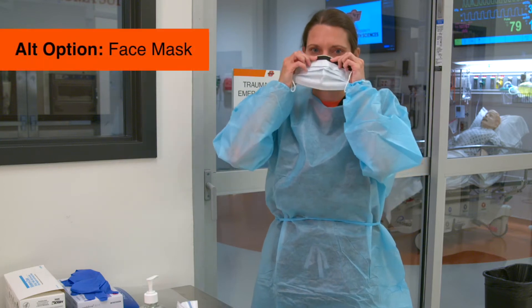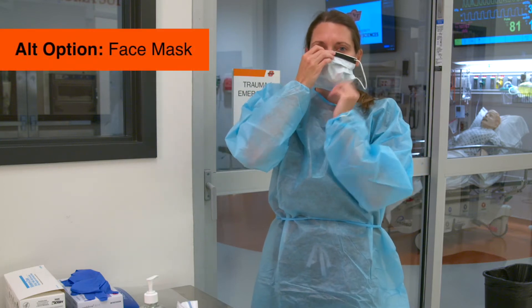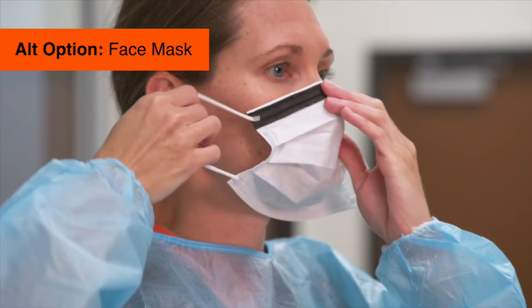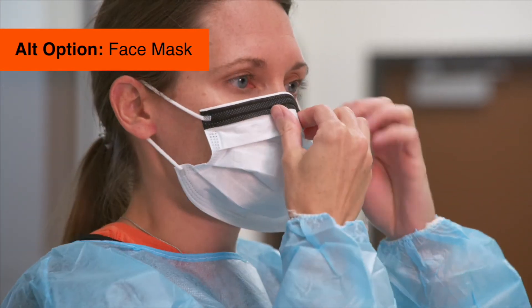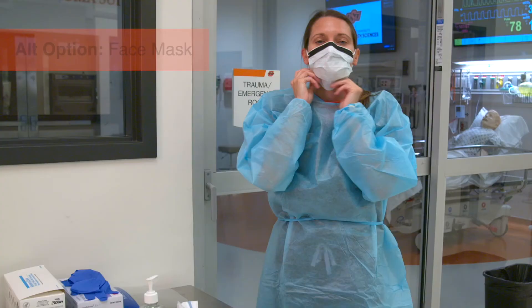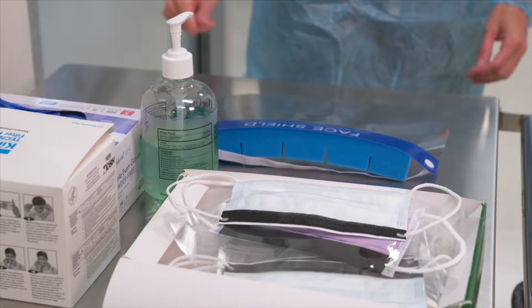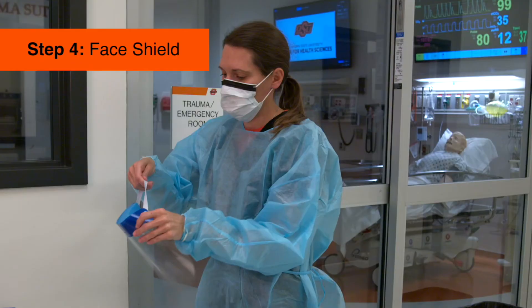If a respirator is not available, put on a face mask. Extend the face mask under your chin, protecting both your mouth and nose. If the mask has loops, hook them around your ears. If it has ties, secure them at the base of your neck and crown of your head. Next, put on a face shield or goggles.